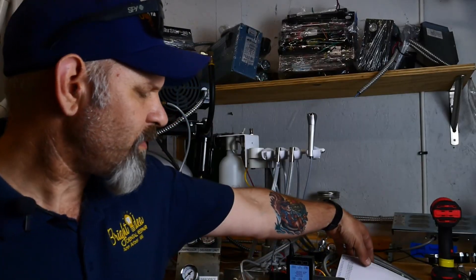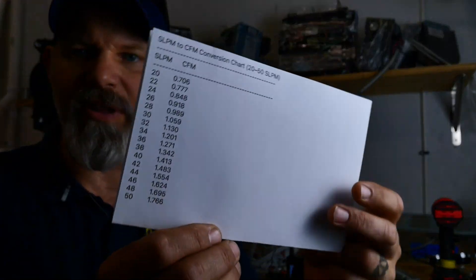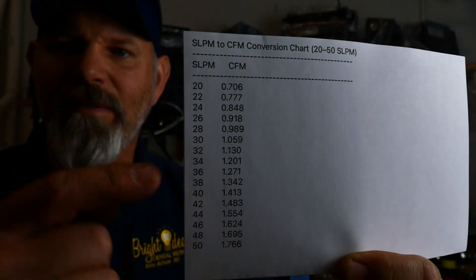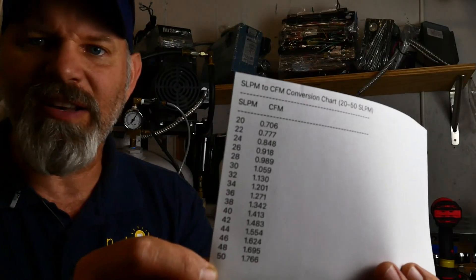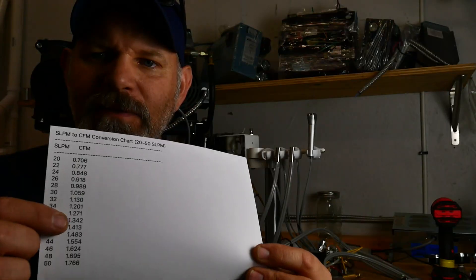I have a CFM checker — it's an airflow tester — and it tests in standard cubic liters of air per minute. I did a conversion: 20 standard liters per minute equals 0.7 CFM, and 50 is 1.7 CFM. When I did this testing, I was fully expecting everything to fall within the range I had previously told people, but that wasn't at all what happened.